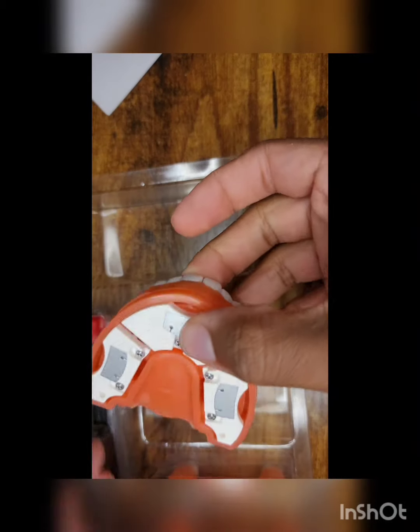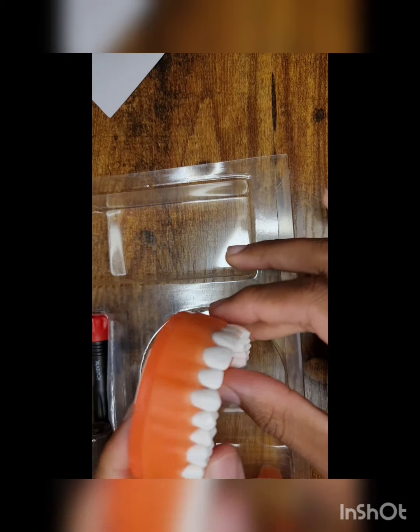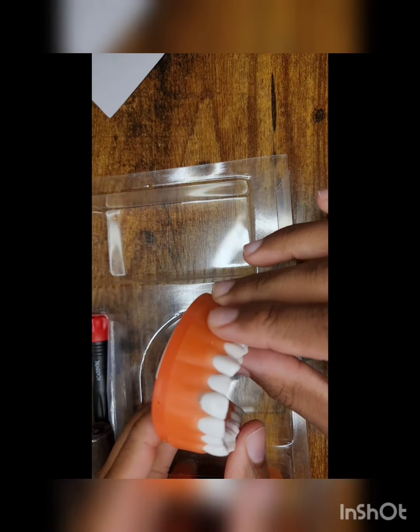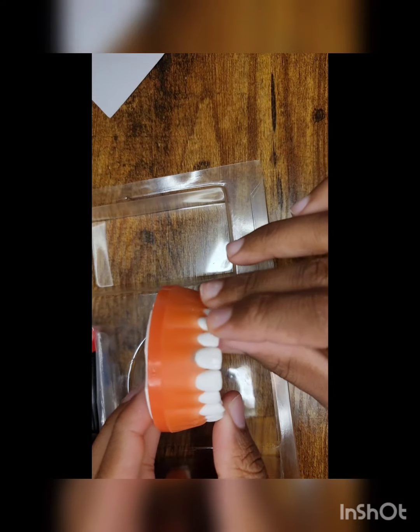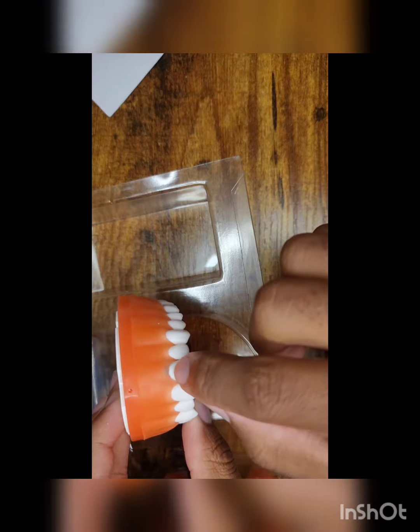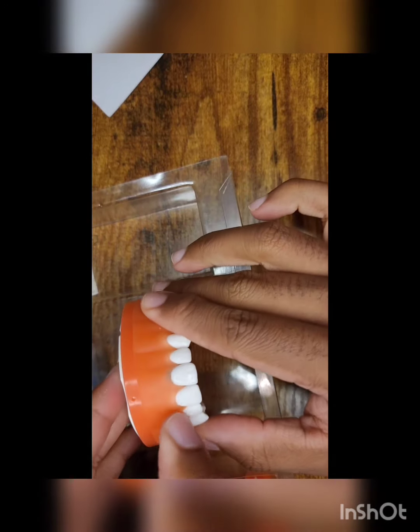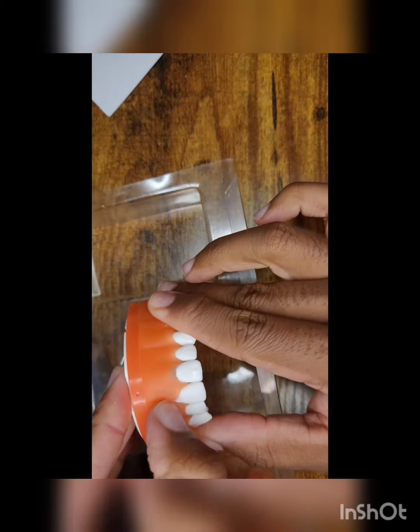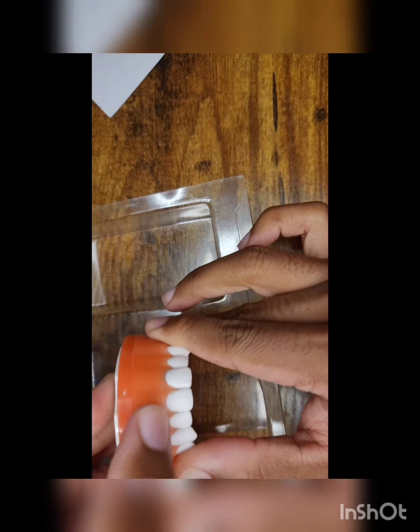Here I have the maxillary arch, and it is similar to the endo arch if you have seen that before, where it has three different sections and each section can just be unscrewed. Here we have the teeth, and under number 9 you do see some calculus that I have applied prior to this video. The gingiva is actually really nice — it's spongy-like, and you can go ahead and actually get instruments under there.